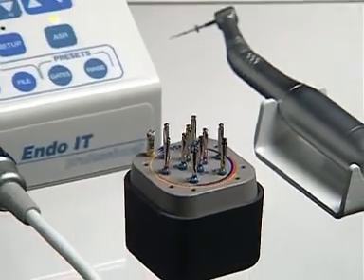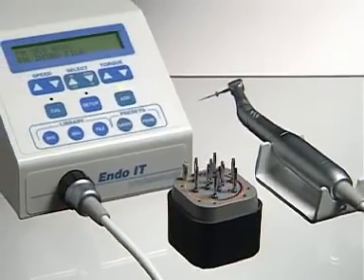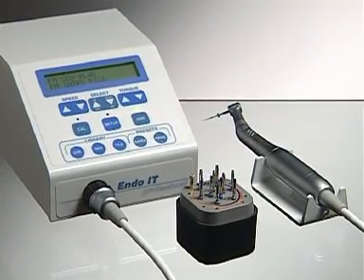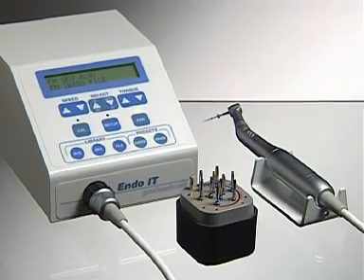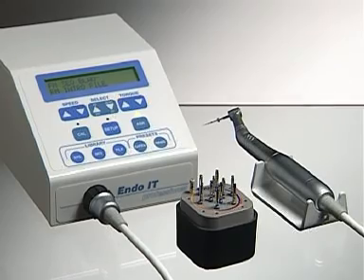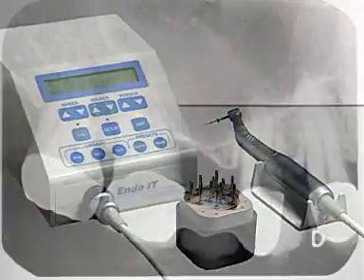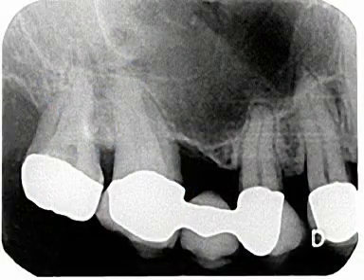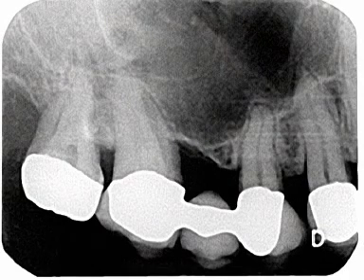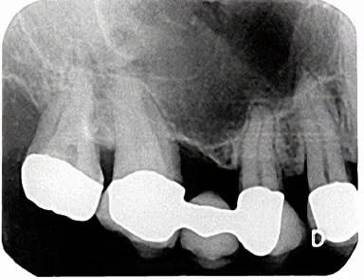In the case shown here, the FlexMaster NiTi file system is used together with the Endo-IT Professional motor in the crown-down technique. The tooth being treated is the upper right 7, which has 4 roots, not all of which can be seen on the X-ray.